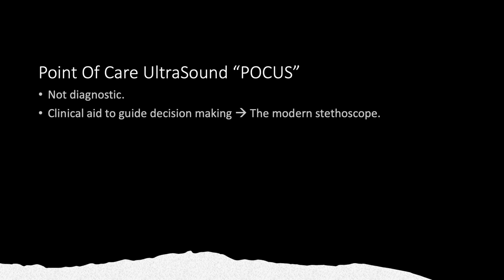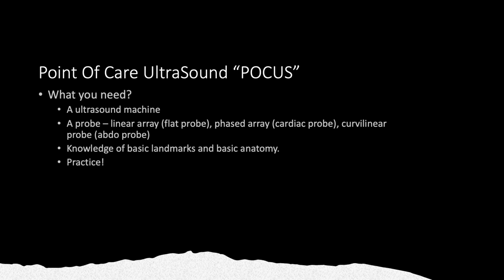So just a little bit on point of care ultrasound, also known as POCUS. Really it's not a diagnostic medium, it's a clinical aid to guide decision making, i.e. it's the modern stethoscope. It's going to help you in guiding your next steps in management and whether you're going to order further imaging or not, or can make the diagnosis based on what's clinically in front of you with the information you have and that you gather from the ultrasound.